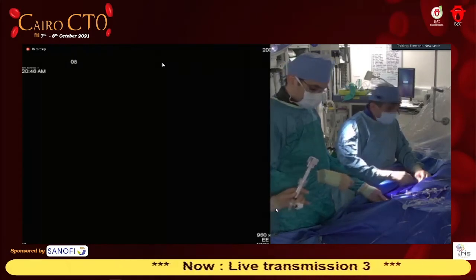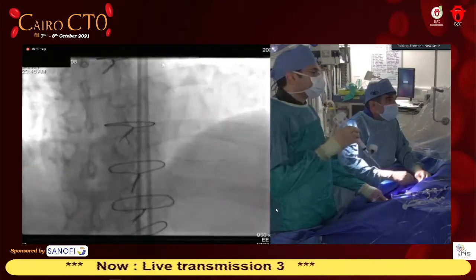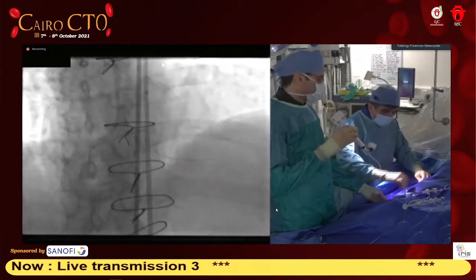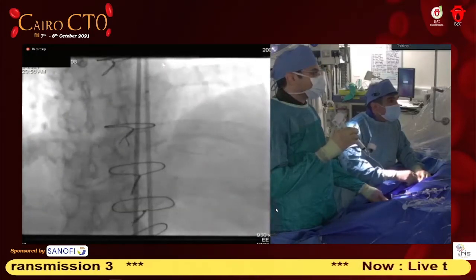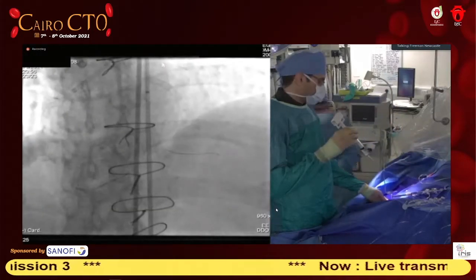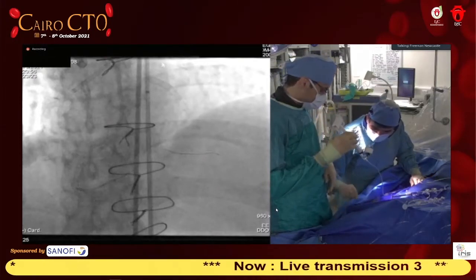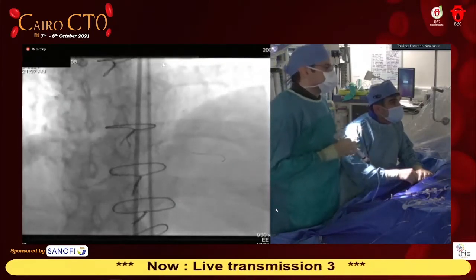So that's kind of a nice trick too, because the guideliner sometimes, I took a 6 French on purpose so I don't have to be struggling through it. So you can see the guideliner has arrived before the stent. Now, if I'm struggling, I'll just push the stent through. I'm just going to wash my hands in here. Just let the wire go, please. And I'm just going to push this down a bit so we're really secure in where we are.